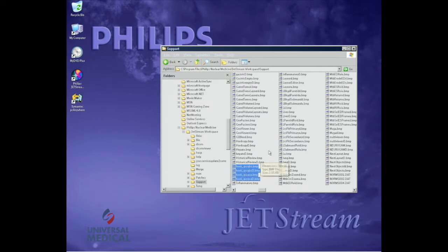You notice all the other icons here, gated tomo, liver, all these icons, they all start with a name. These start with hook that were supposed to be renamed when the application hook took effect. So what I'm doing is I'm just changing the name to get rid of the hook underscore. The icons are in the right spot. They're in program files, Philips Nuclear Medicine, JetStream, support, but they're named inappropriately.